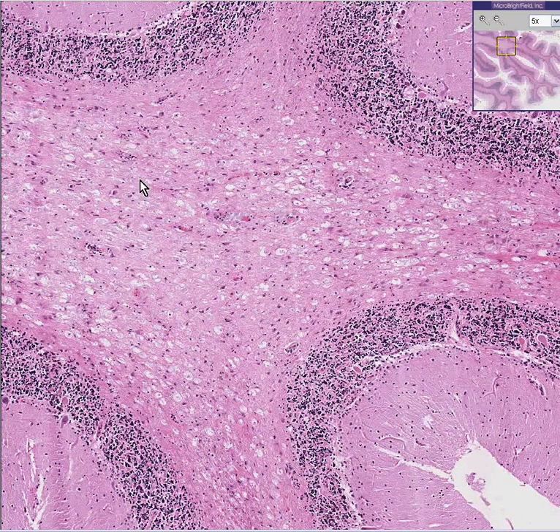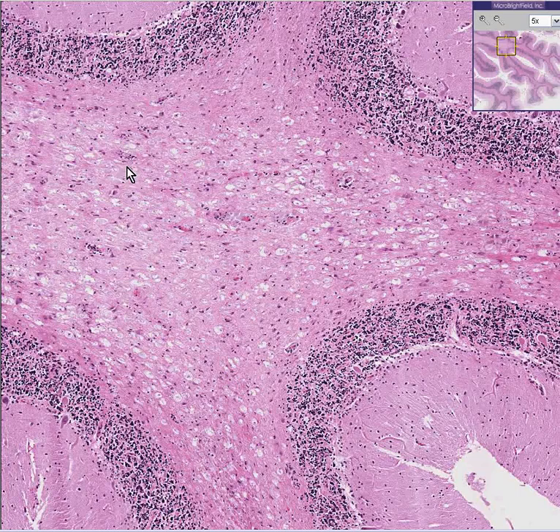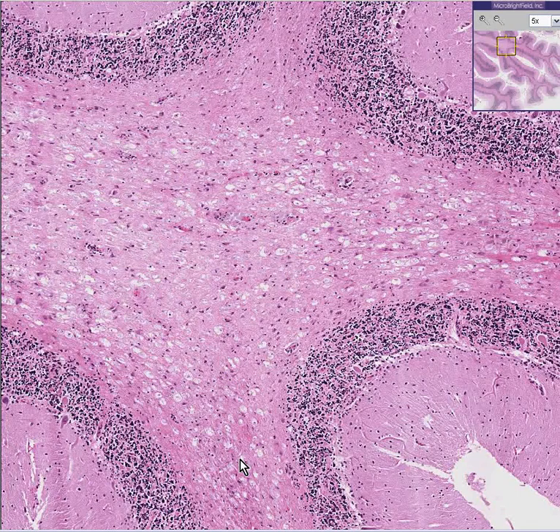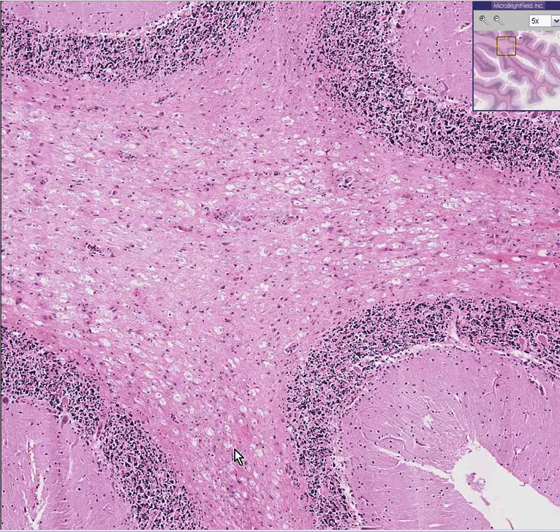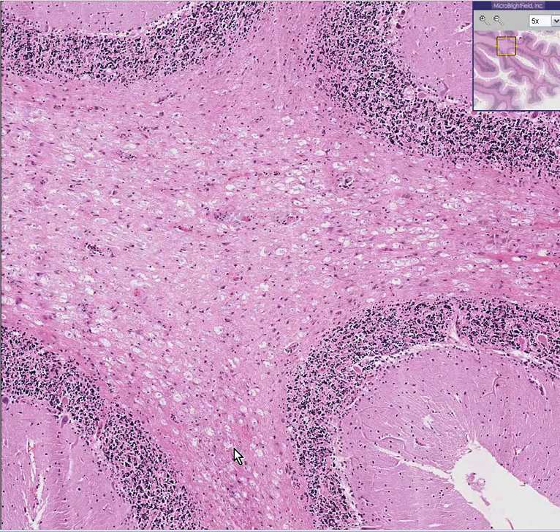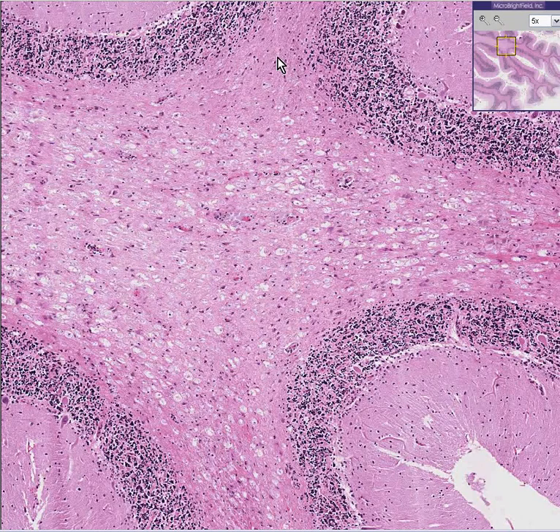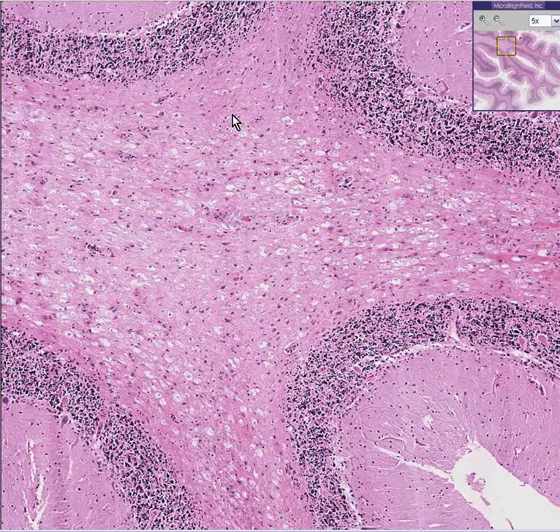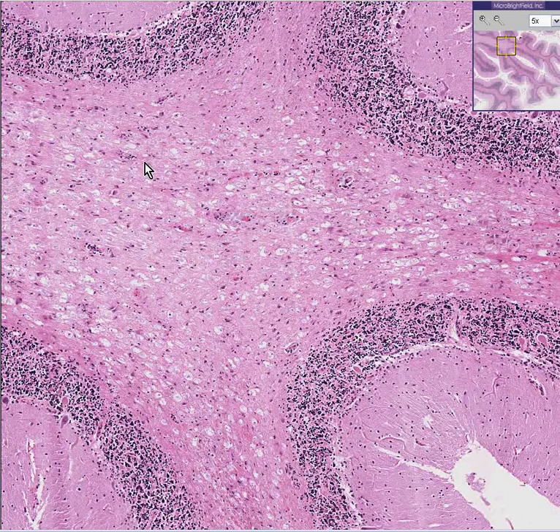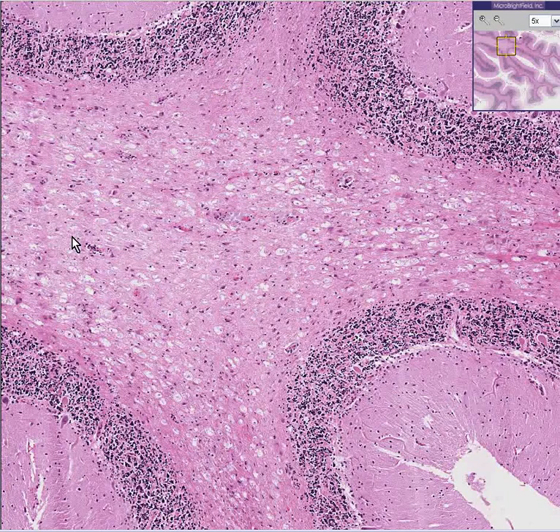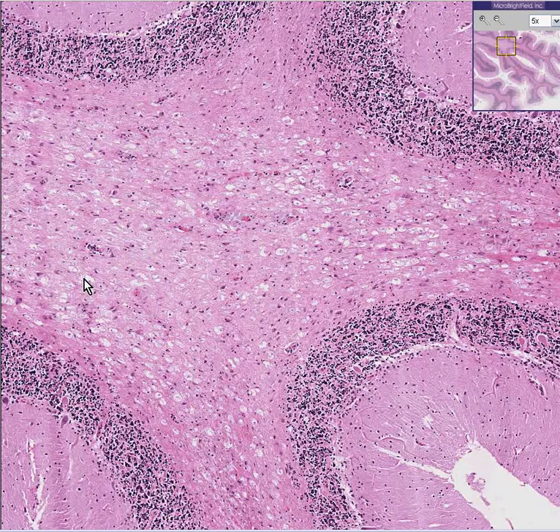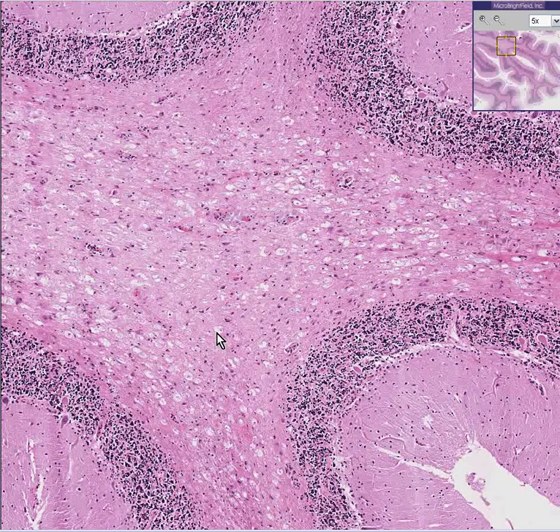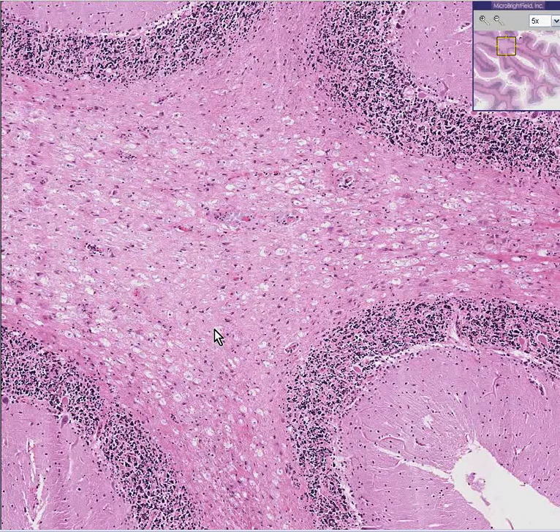The defectiveness you can see. In this area, you have a fairly or less severe amount of abnormal myelinizations. Throughout here, there's a lot of irregular things. You see vacuoles bigger than they should be. That's just defective abnormal myelinization, which all the leukodystrophies are.